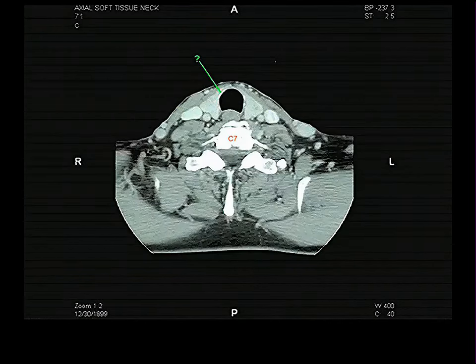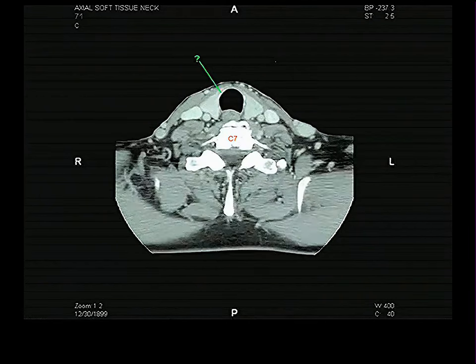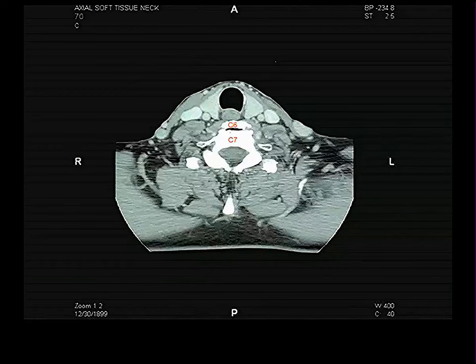Keep on going up. Why can I see that white in the trachea? Here's another one too. That's white, white, white. Why can I see that in the trachea? Well, say it loudly. Be bold.